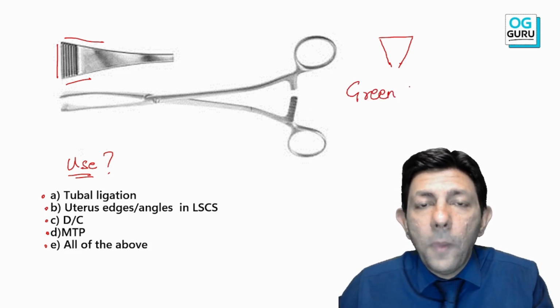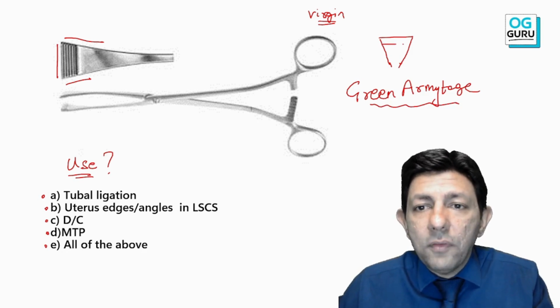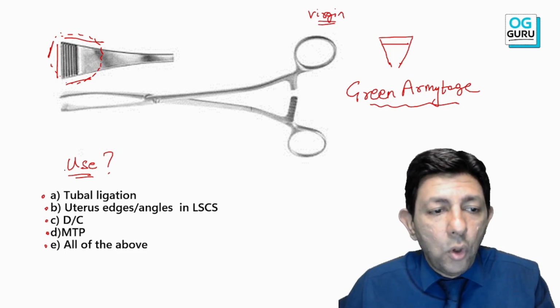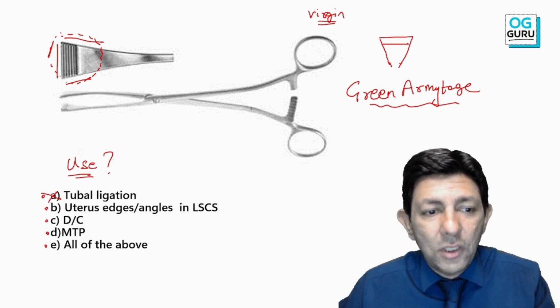Majority of you have not been shown this instrument in your final year, and that's why it is very likely to be coming. Of course, this is a Virgin MCQ likely for the future exam. Green Armitage forceps, and where is it used? The part of this, as you can see over here, acts as a temporary clamp, so that the blood loss is reduced. So it is not used in tubal ligation. Which instrument I'll use for tubal ligation, I will show you again in this session only. Of course, there is no role in DNC and MTP.